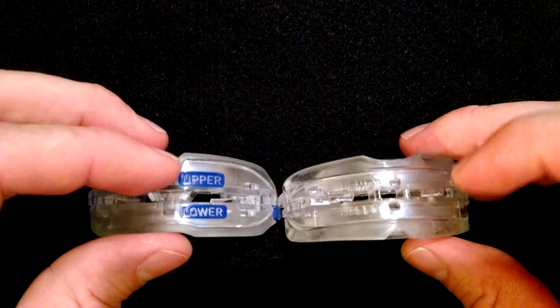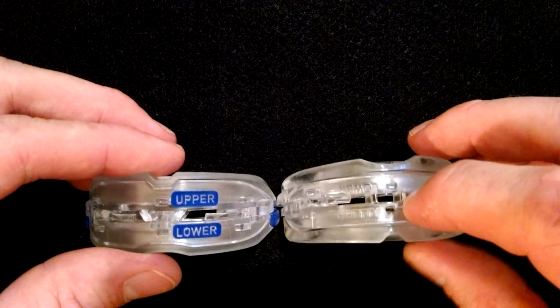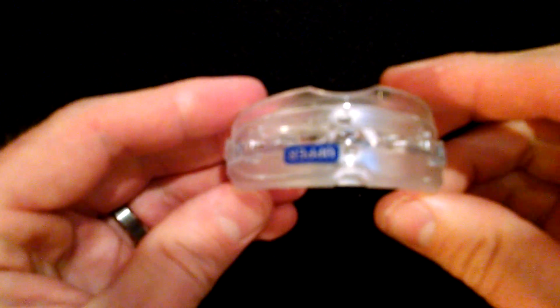These products are actually so similar. You can take the upper tray from the Snore RX and attach it to the lower tray of the Eliminator Pro. I can go ahead and do this right now and show you what that looks like. Not that you would want to do this, but just to show you how similar they are to one another. And there. This is the two fitted together. So they use the same framework, basically the same mold, with the exception of the Snore RX being tapered a bit more at the rear.